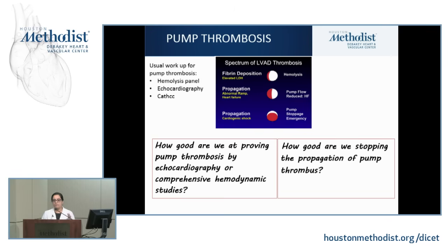So between no thrombus and occlusive thrombus, there is that category of partial thrombosis. With partial thrombus, you could still unload. It's not going to give you any meaningful information from the RAMP, and you have to just follow clinically. I know we order a lot of RAMP studies and they're painful, but the only thing it can tell you is whether or not it's a completely occlusive thrombus. It doesn't discriminate between partial thrombosis and no thrombosis, so that you have to do clinically.